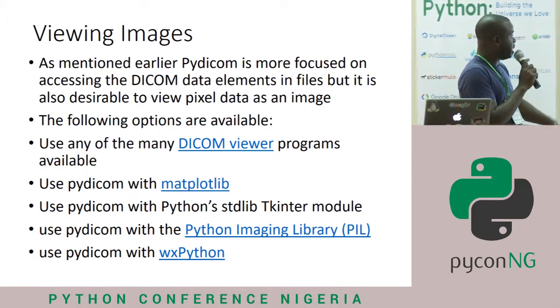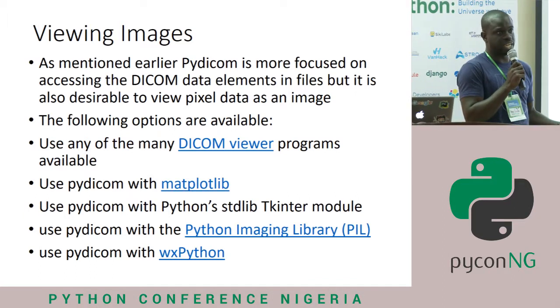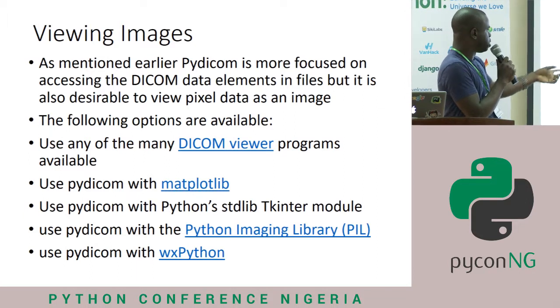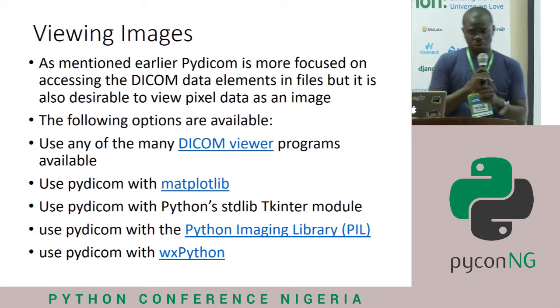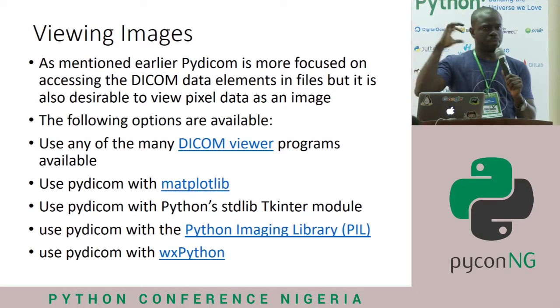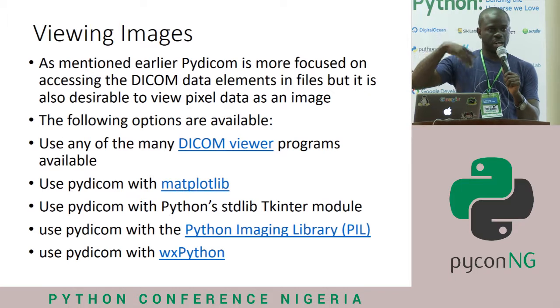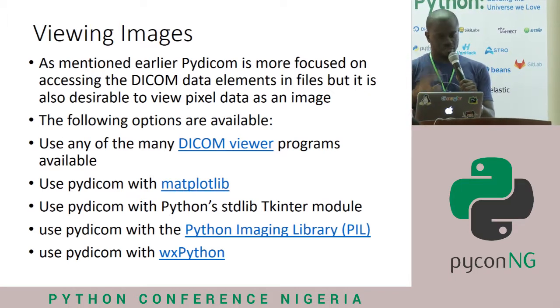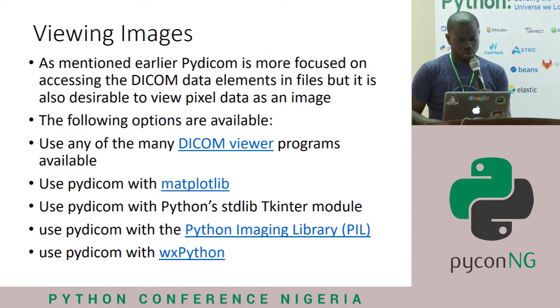As mentioned earlier, it's not majorly designed to view images, but it could also view images through the following options. Either you use external libraries that are built for that purpose. If you are a bit familiar with that space, you would have heard of Clear Canvas and a couple of other tools designed specifically for viewing. They have some complex tools that allow you to do some modifications. So I will bring that up.